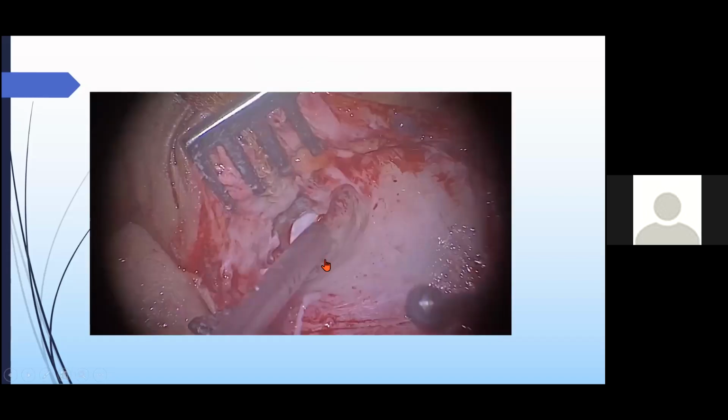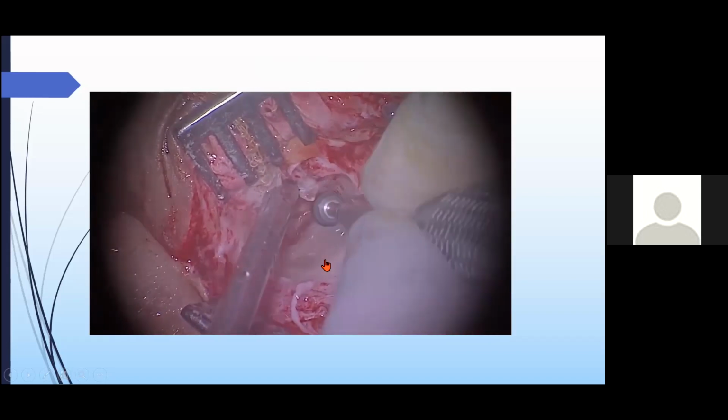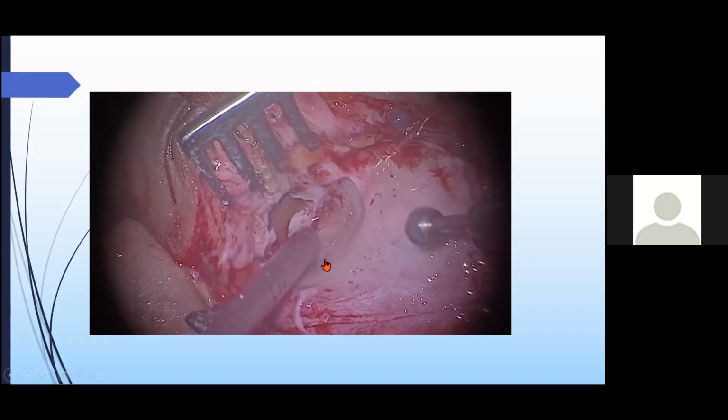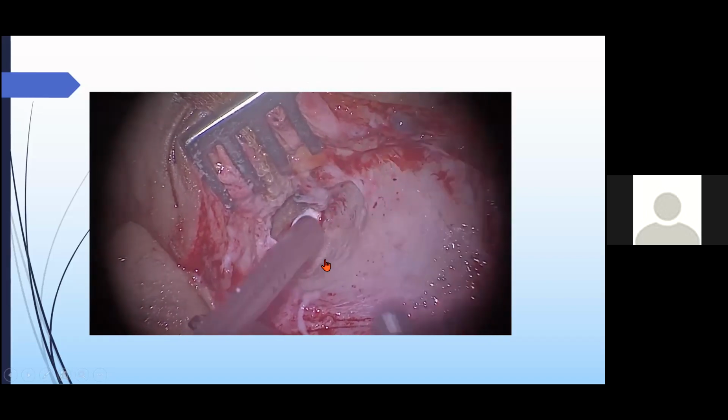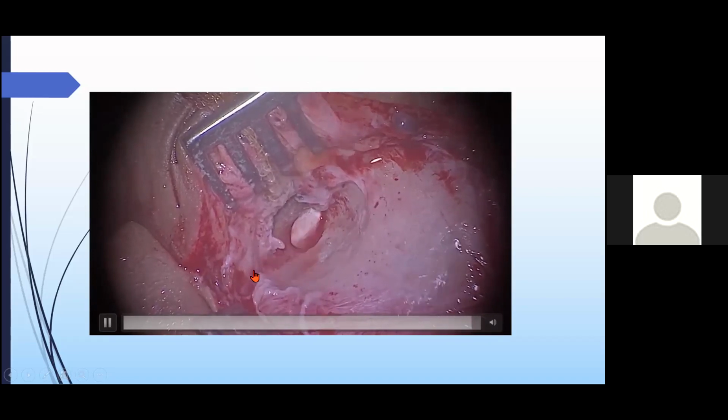And then we should proceed along the superior and the inferior canal wall. See, here the drilling proceeds from medial to lateral, inside out, because this is the safer access. The safer access on the posterior wall was this, but on the superior wall and inferior wall it will be this.